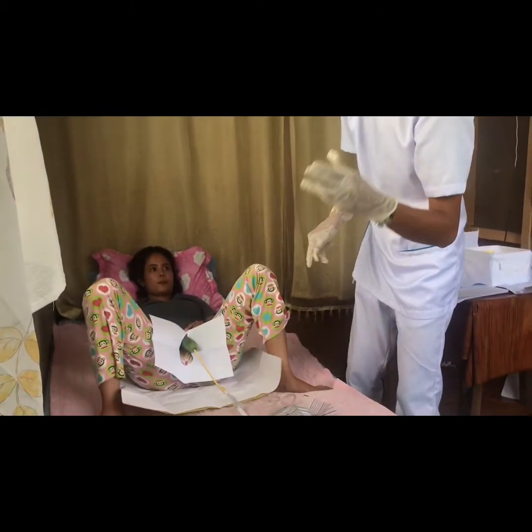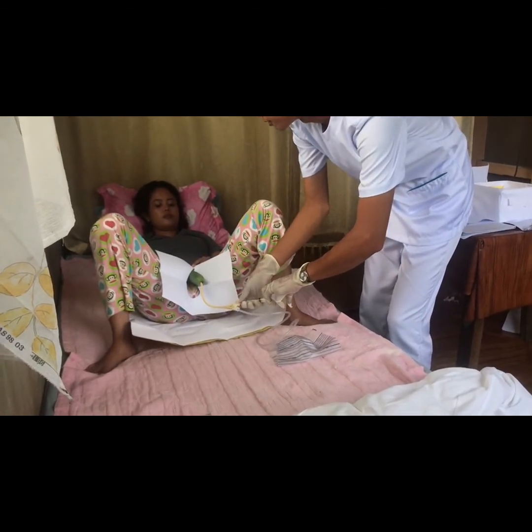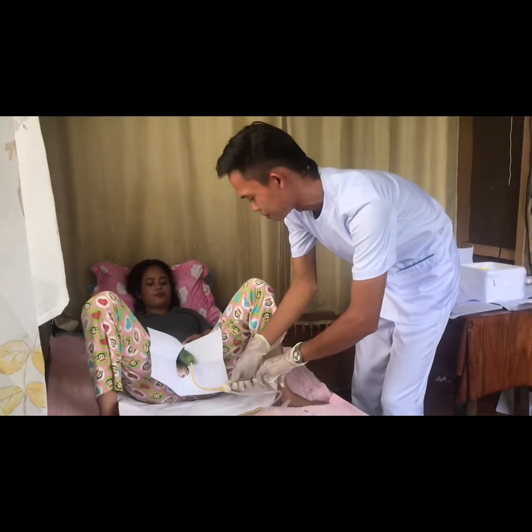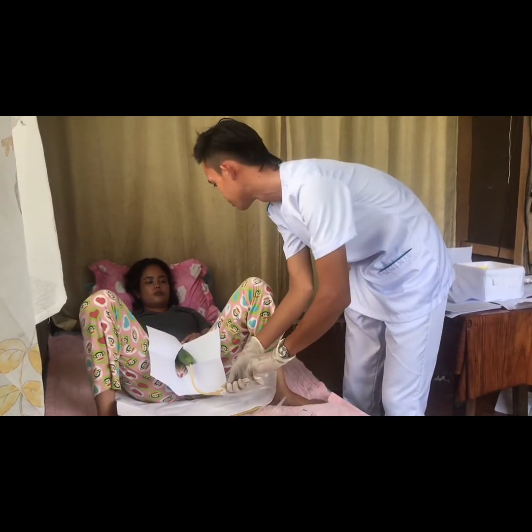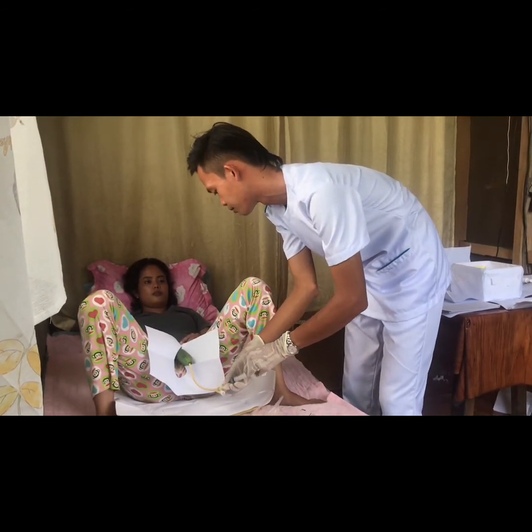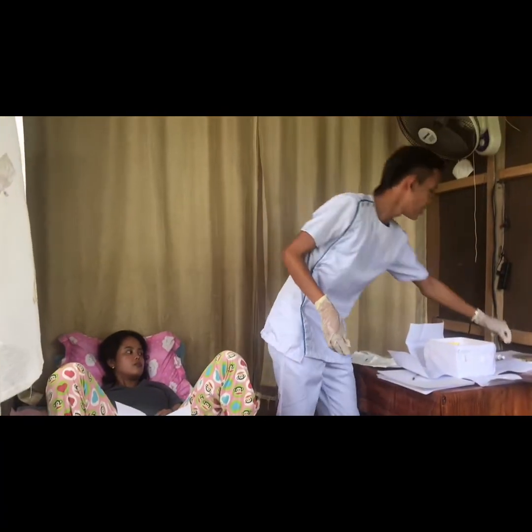Okay, so after the catheter is inserted into the penis of the patient, we are now going to inject the distilled water from the syringe. You okay, sir? Yes. Everything's well? Yeah. Okay. I'm going to detach it and place this one in this portion.